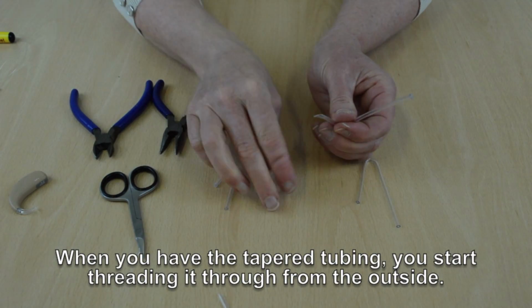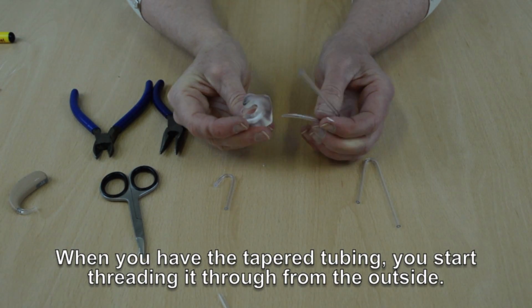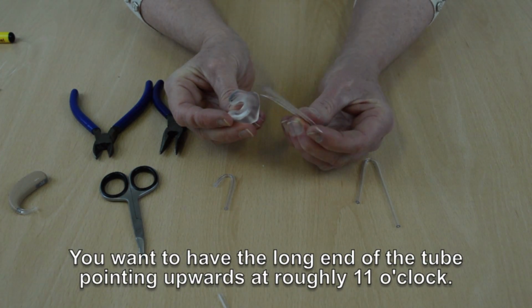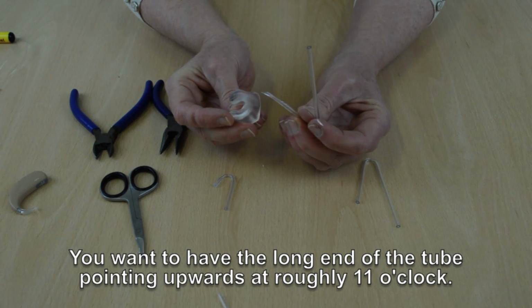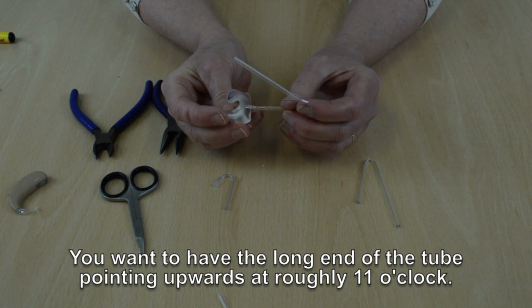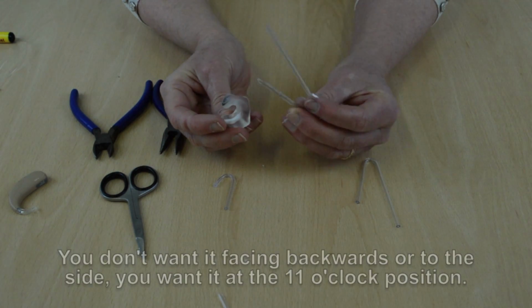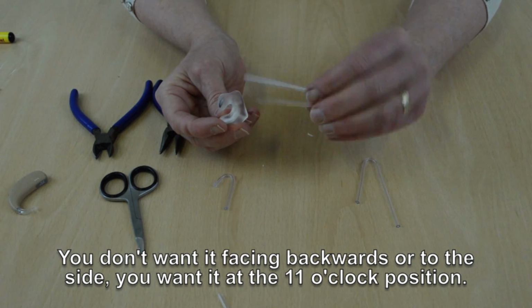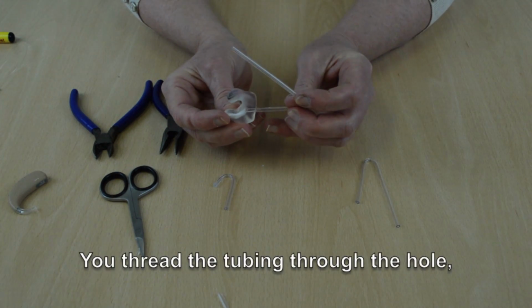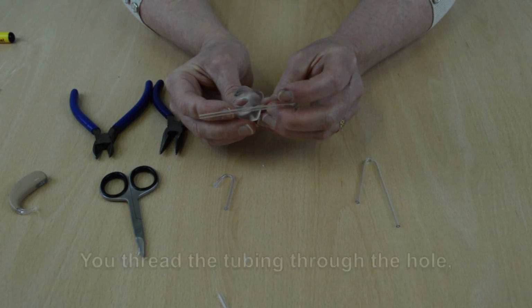When you have the tapered tubing, you start threading it through the ear mould from the outside. Again, you want the long end of the tubing pointing at roughly 11 o'clock. You don't want it facing back downwards or to the side. You want it facing at about 11 o'clock. You thread the tubing through the hole.